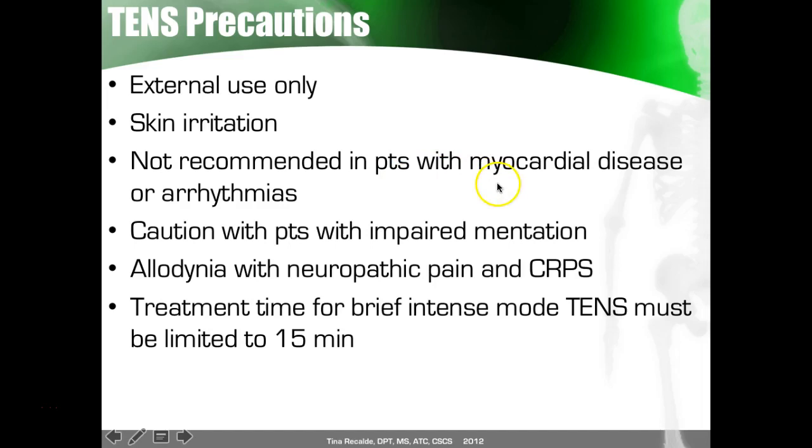It's not recommended in patients with myocardial disease or arrhythmias that are unstable. Definitely want to be cautious with those patients with impaired mentation. It may be that you're just going to use it while you're there present with them, not to let it be something that they take home with them, or leave if they're in the skilled nursing facility and you put it on them and you leave their room. That's probably not a safe idea.